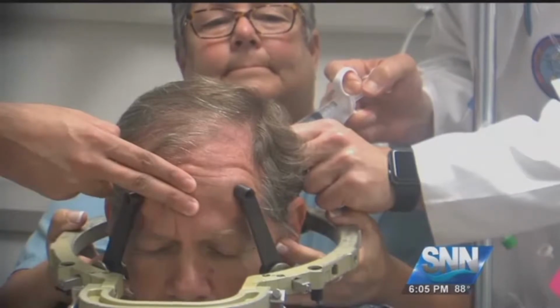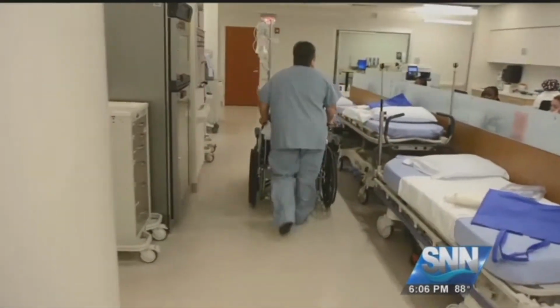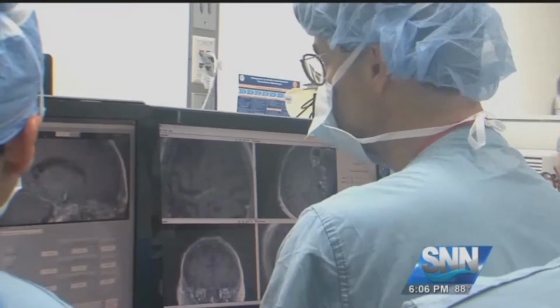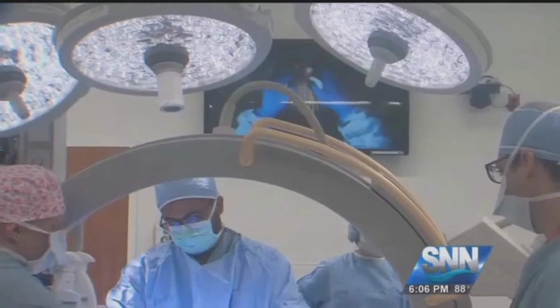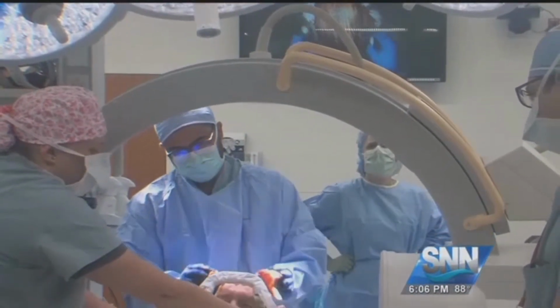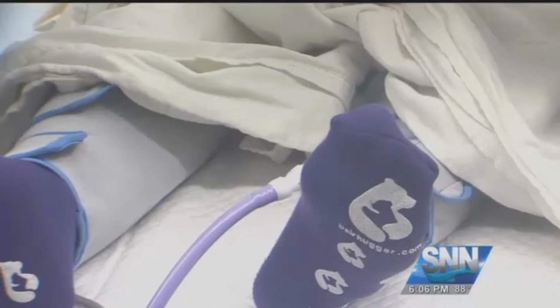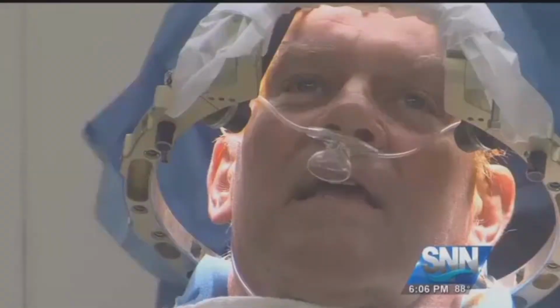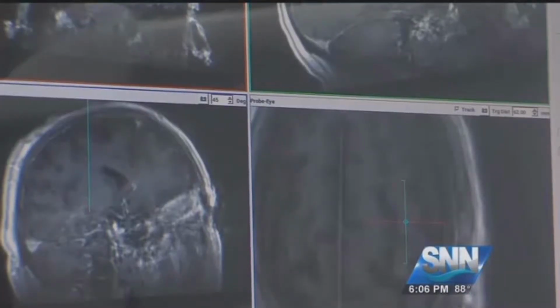Parkinson's disease is a disease that makes it so you can't move the way you want to move. PJ's movement circuit isn't functioning properly. That's why we're here. We get the DBS lead in just the right spot where the bad signal is coming from. We deliver rapid pulses of electricity that sort of act like white noise and cover up that bad signal, which allows the rest of the motor network and that circuitry to function better. The lead goes in the right side of PJ's brain, which controls movements on the left side of his body, where he's had the most trouble. Wild dyskinetic movements or extra involuntary movements, stimulation really suppresses those nicely, and I think that's one of the things that PJ is looking forward to.